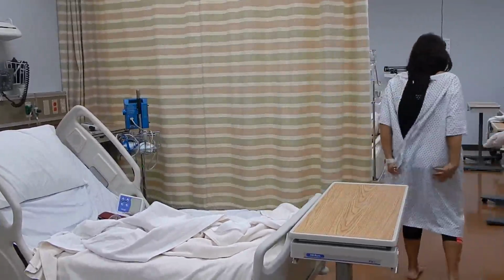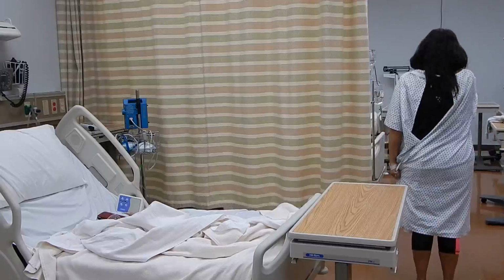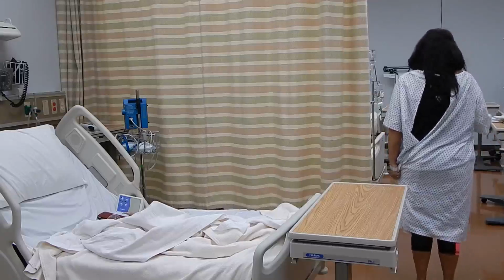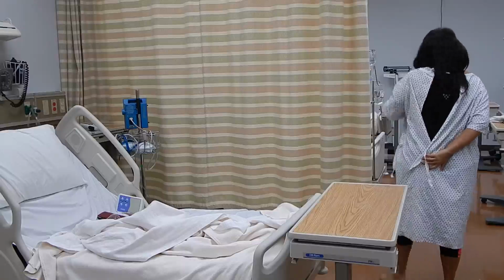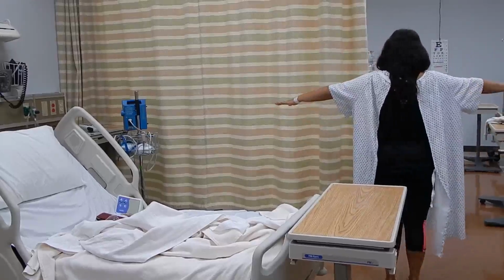Ask the client to stand 20 feet from a Snellen chart to test distant vision. Read the smallest line the client can see with one eye closed and alternate between eyes. FBPLTCEO. Wonderful. And can you close your eyes and put your hands out? Yes. Awesome.